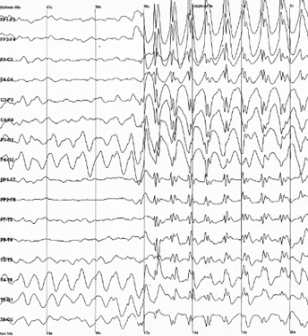Intracortical encephalogram electrodes and subdural electrodes can be used in tandem to discriminate and discretize artifact from epileptiform and other severe neurological events. More advanced measures of abnormal EEG signals have also recently received attention as possible biomarkers for different disorders such as Alzheimer's disease.